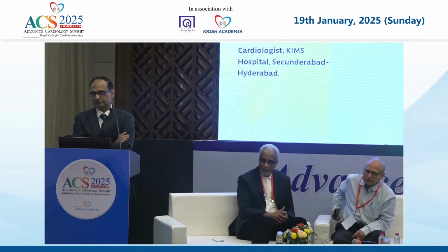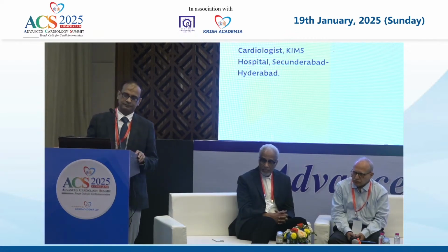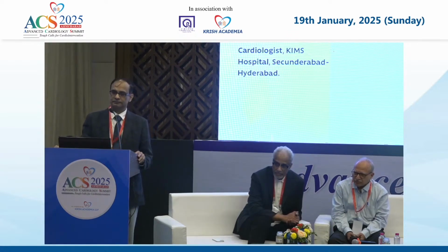Ajay, a couple of things. A question was asked about the mismatch. I think Seung-Jung Park's paper mentions the mismatch and the reverse mismatch, where the lesion looks extremely tight and yes, the FFR could be completely normal. It could happen very often in circumflex lesions. One question is that many times we come across a CTO that is richly supplied by collaterals, angiographically at least. How do you assess whether this CTO is producing ischemia or not?